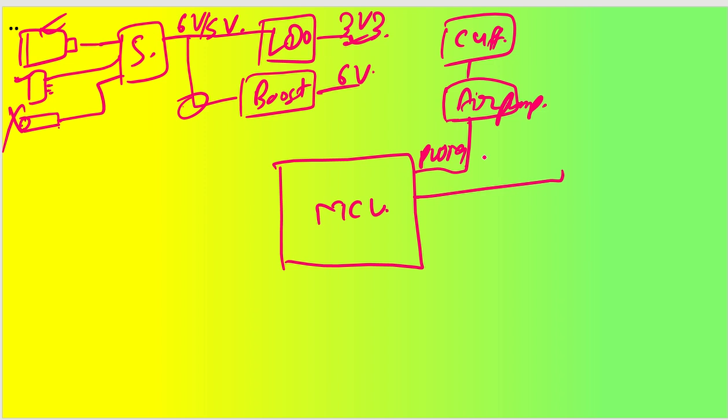One more PWM will be working for my air valve as well. So the air valve actually gives us an opportunity to open and close. Once it opens up, the air pump has inflated the cuff and it will deflate it, right? It will allow the air to pass out. So this is how it works. So this air cuff will be connected to the air valve as well.